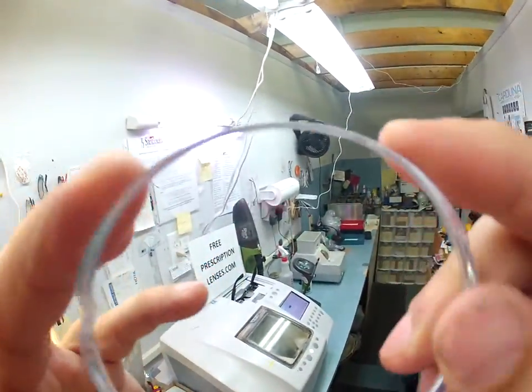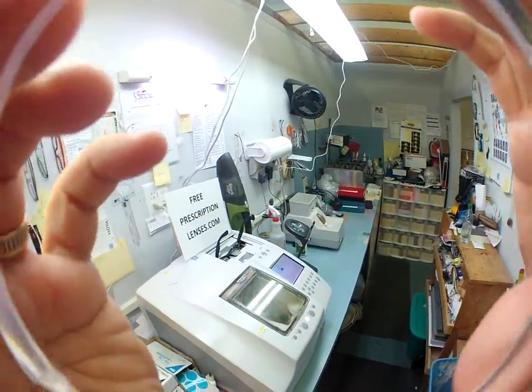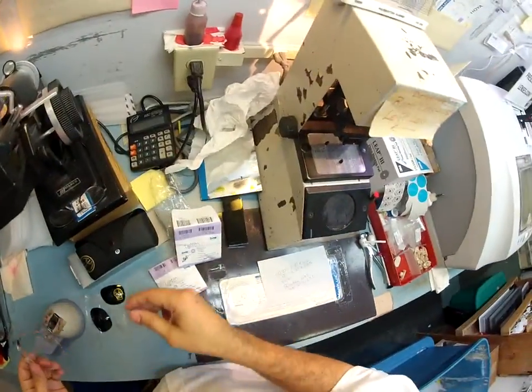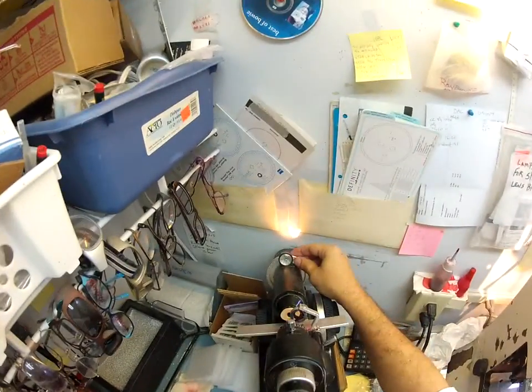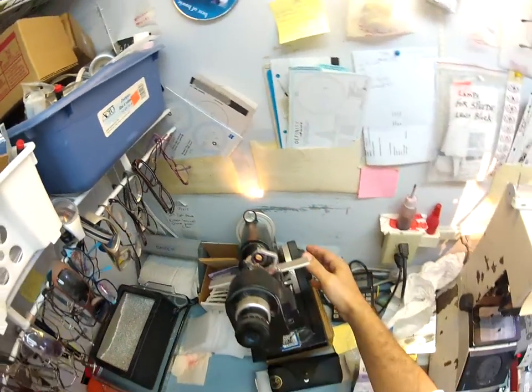I pull it out of the package. How's this for special effects? Look through there — those are your eyes. Let's get to work. Minus 50, minus 250 at 102. So I spin the axis wheel on my Marko 101 lensometer to 102.